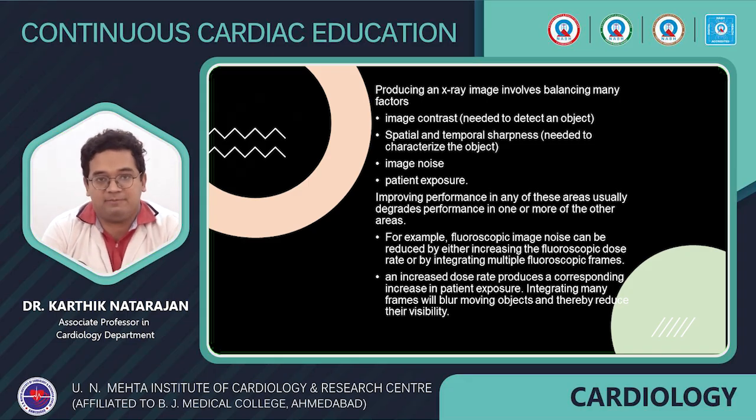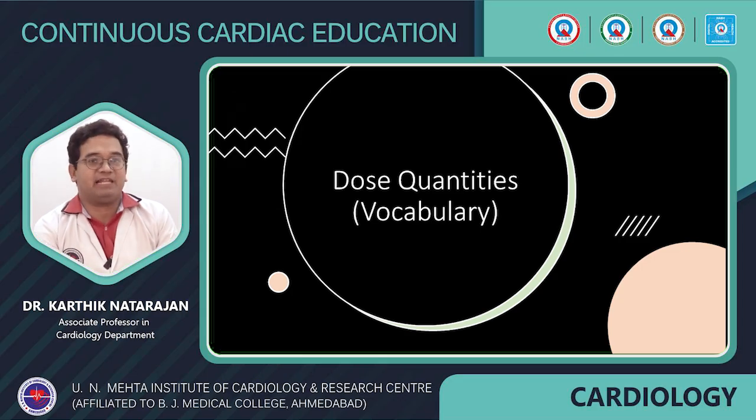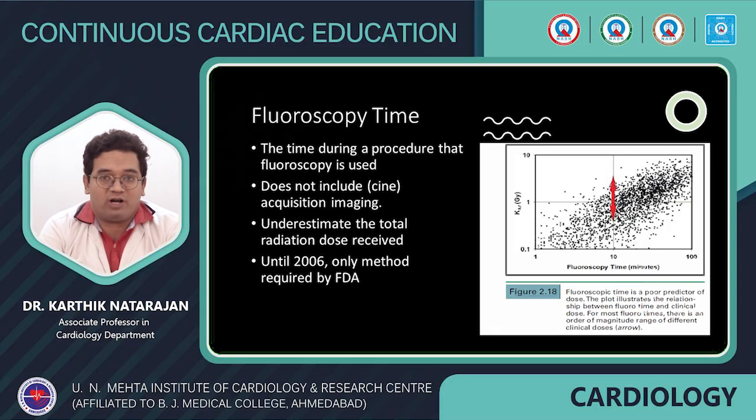doctor or the operator. Now, you need to know some dose vocabulary which is commonly mentioned in most of the textbooks as well as in most of the lectures. So, what is the fluoro time? It's simply the time during a procedure that the fluoroscopy is used.